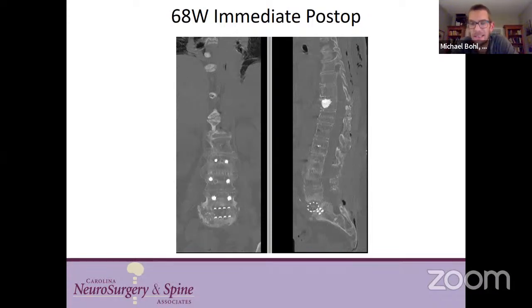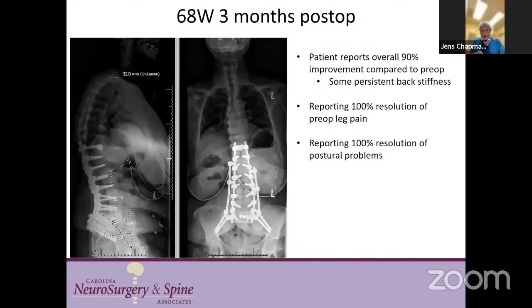Like I said, this patient's 3 months post-op. These other ones are all 6 months post-op, and so far no failure of those sideways Harms cages. I have mentors too from training who would do these, and they were big fans of the sideways Harms cage. But it's just something I found to be very useful. And you put that in from the front, right? No, from the back. Wow. Yeah. Okay. That's remarkable.